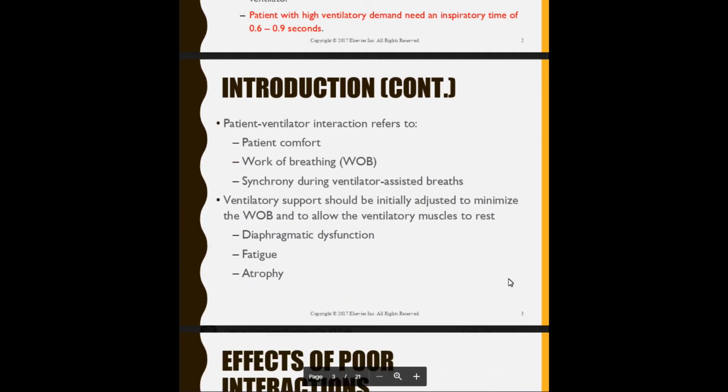Now, they say ventilatory demands because we're trying to ventilate them. If we had low flow and that increased I time, decreased E time, they start auto-peeping, and they cannot breathe out the carbon dioxide, then they can't ventilate. So therefore, we are not meeting their ventilatory demands.